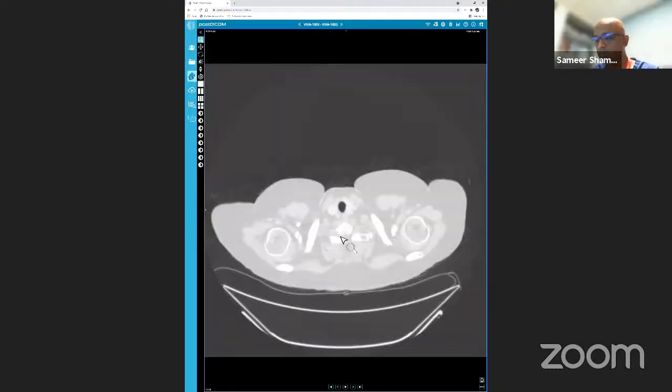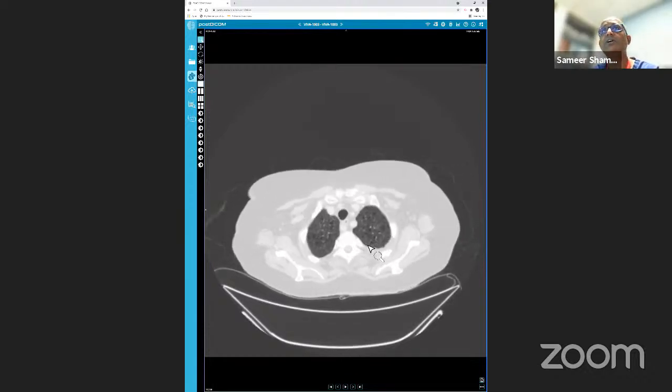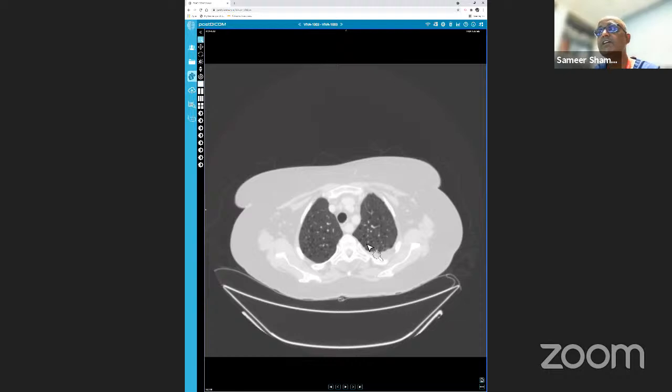Case number 3 was spot on. These are classic cases that you will get in the exam. So in the exam, your approach should be, you won't see weird and wonderful things for sure. If there are 100 cases, 80% will be classic cases. There are three types of cases that you can get in the exam. One is a classic Aunt Minnie like this one, where you have got the cyst-like appearance, scattered, very thin-walled LAM. And then you approach it in a very nice way.